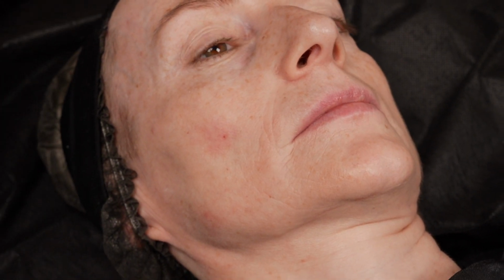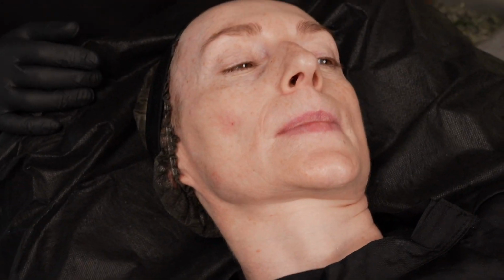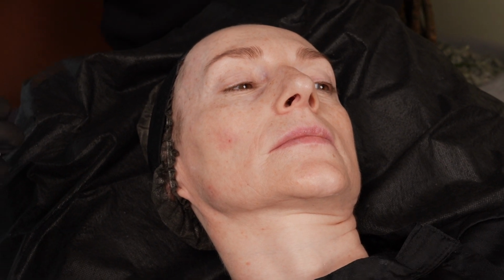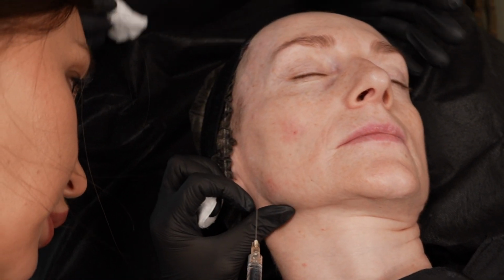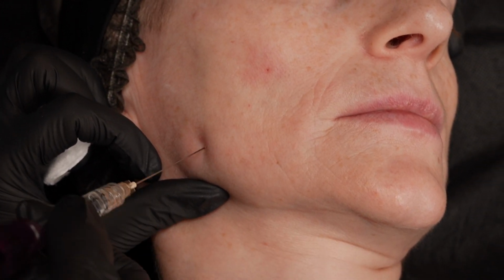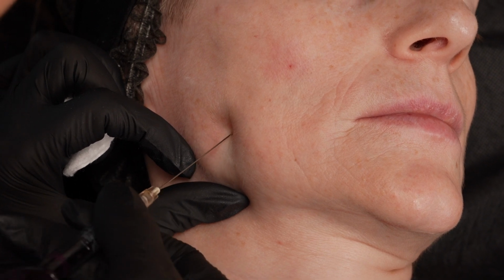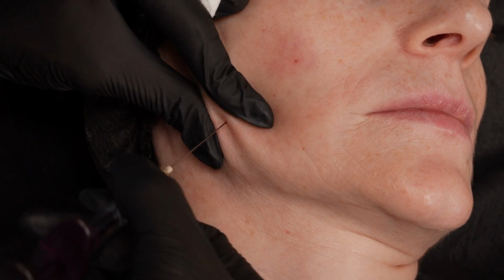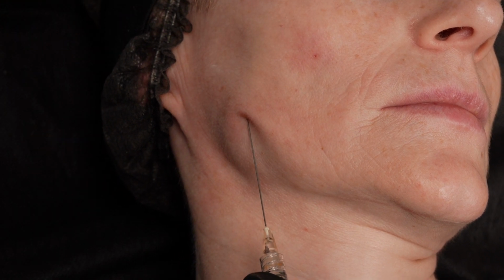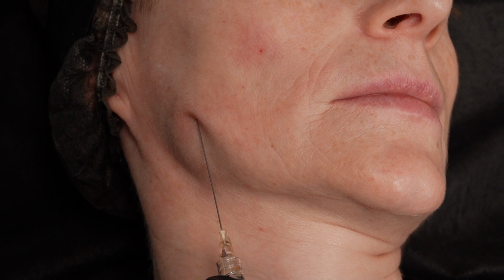Okay. Now here. Yes, everyone agreed with your idea. Good. Сам доктор пускай приглашает свою модель. You open your way this direction. If you open this direction with your guide needle, your cannula go this direction.